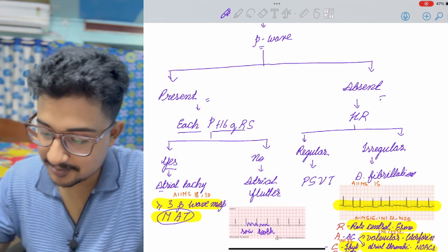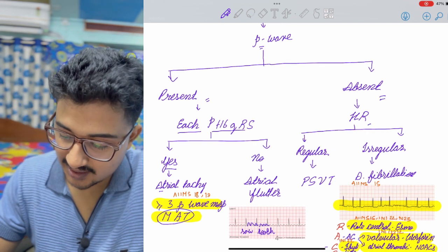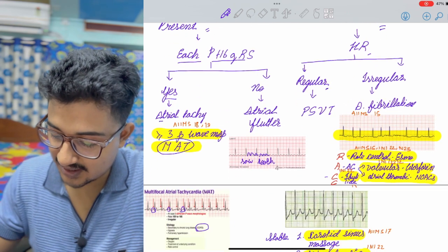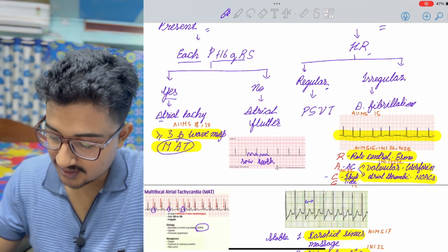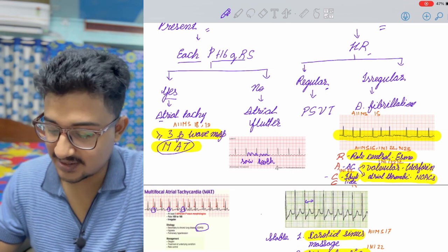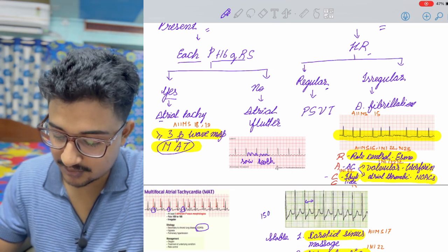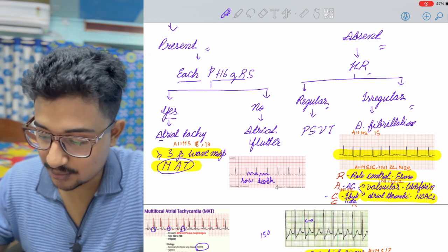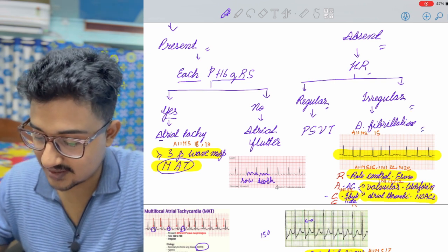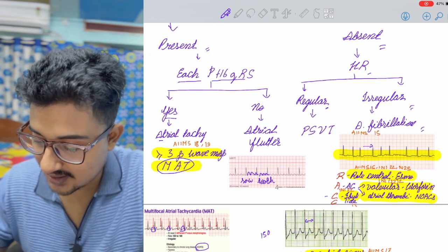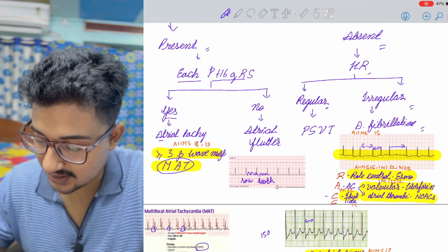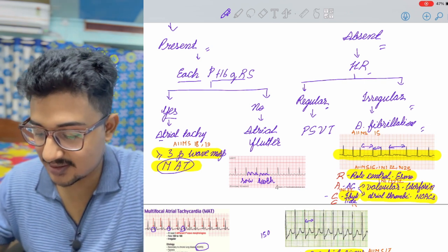If the P wave is absent and heart rate is regular, then it is a case of PSVT. You can see regular interval, two large squares, that means a rate of about 150 beats per minute. But in case if it is irregular, then it is AFib, atrial fibrillation. See the RR interval is variable. So the heart rate is also variable. Here you see the RR interval, it is much larger.